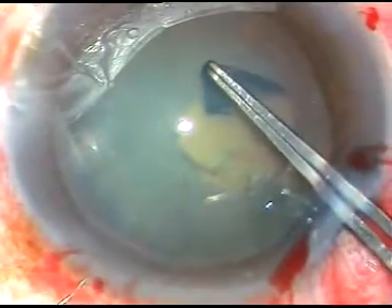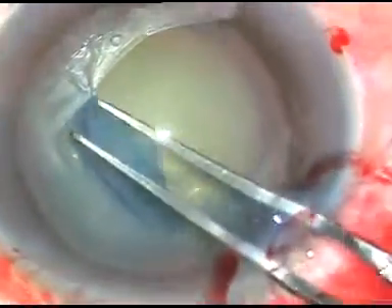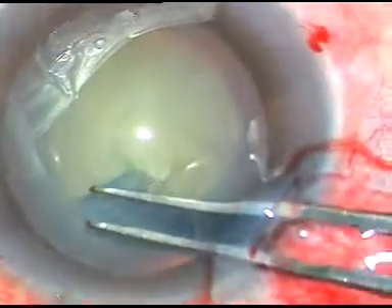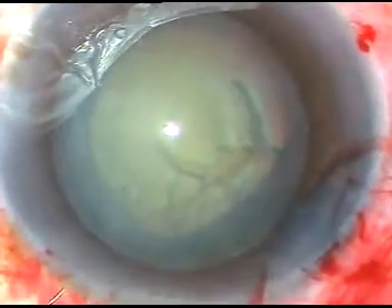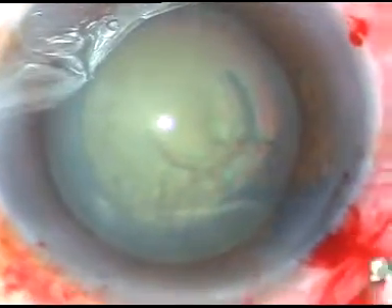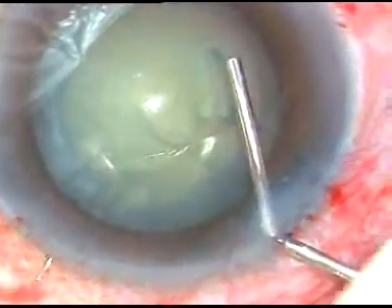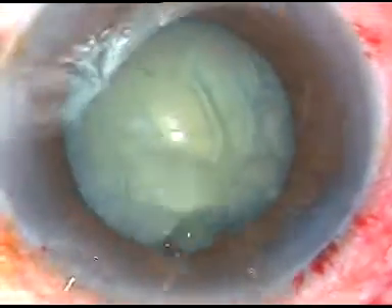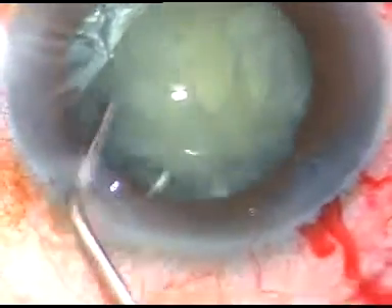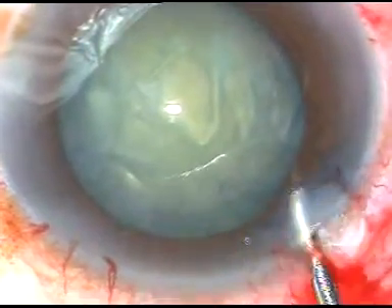I hold this capsular flap with a Utrata forceps, rest against the anterior capsule at the main incision, and make this continuous curvilinear rhexis. The rhexis was initially circular but at the end it has got some extension towards the periphery, so it's not a perfectly circular rhexis but it's a continuous rhexis. The idea of rhexis is to be continuous at all times — it will not always be circular, unless you are using a femtosecond laser.